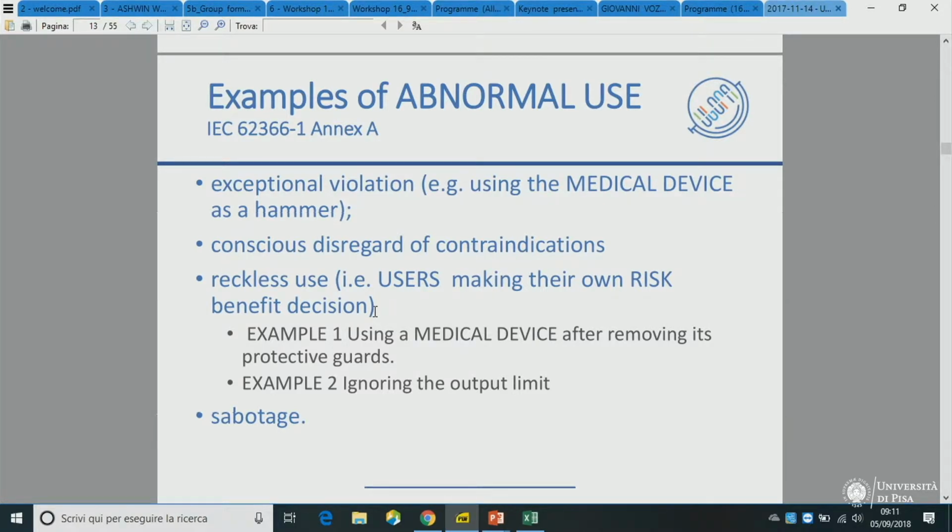Sabotage is what I told you. Or taking an electromedical device and just playing with the plugs because you don't have the, how do you call it, the earth? So they cut the electrical cable and connect it here and there where they find a way, and they don't really think about insulation and things like that. So sabotage.